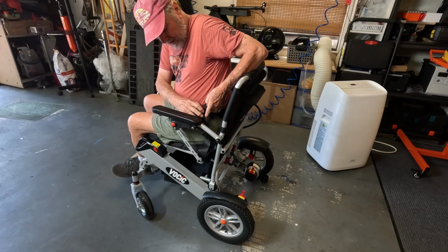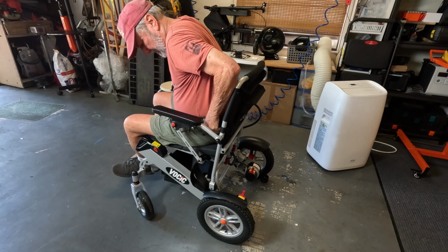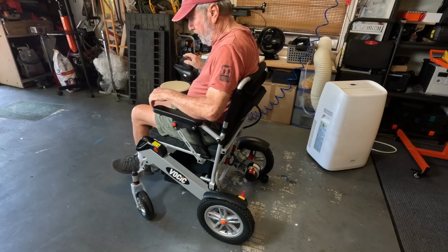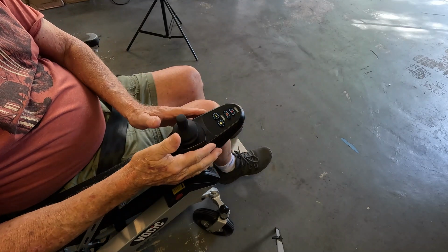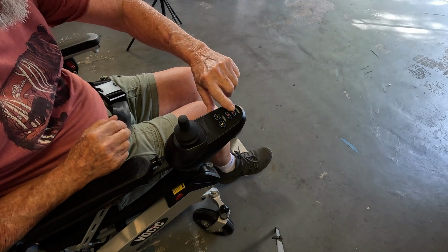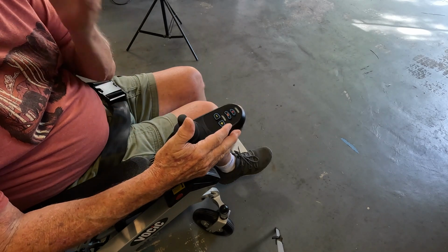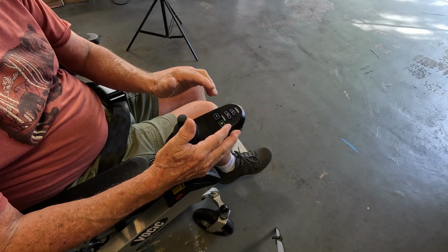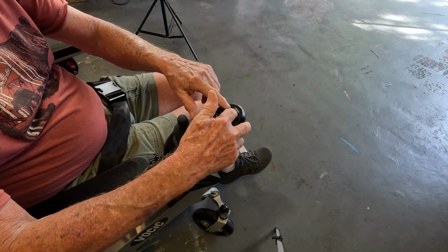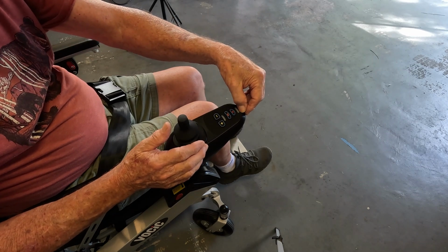And I'll unplug it, and I can strap it on. And that'll secure you. Okay, there's no power on it right now. To put power on, you push this down just for 1 second. To take power off of the controller, you have to push it and hold it for 3 seconds. Right here is a horn. None of the buttons work until you have power on it. And then this is going to display your battery condition.